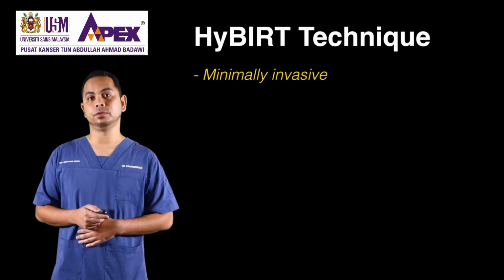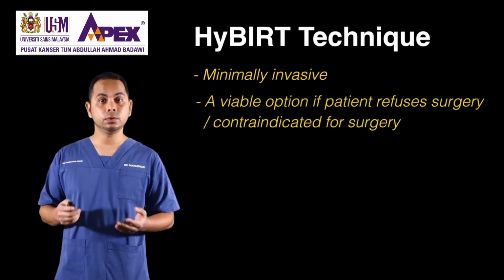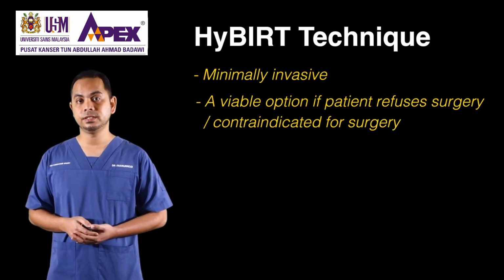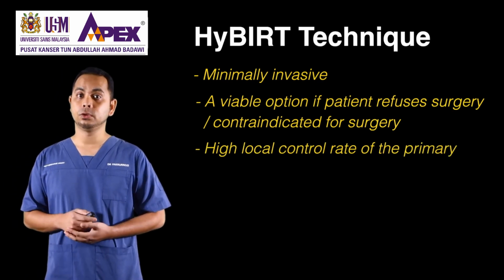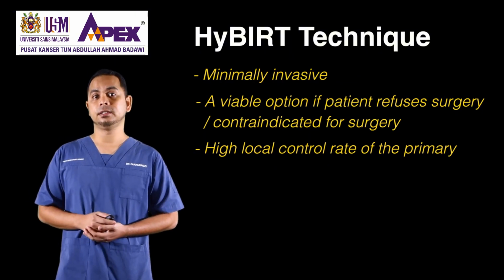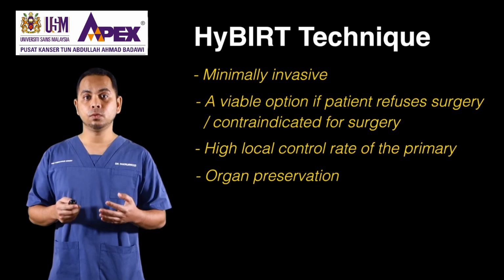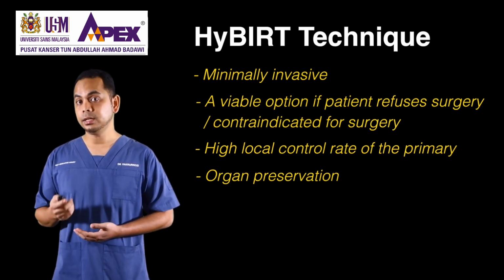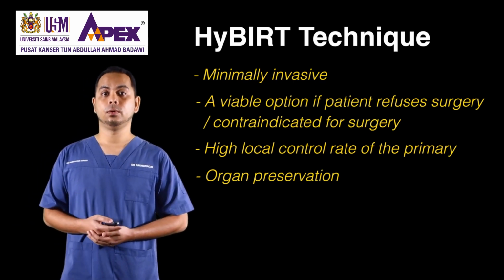So the main advantage of brachytherapy is that it is a minimally invasive procedure, and it is a viable option for those patients who refuse or are contraindicated for surgery. Currently our data shows that we have a high local control rate at the primary tumor. Another advantage is organ preservation. We don't have to remove part of the body in this treatment, and the patient will have reasonably good oral function after that.